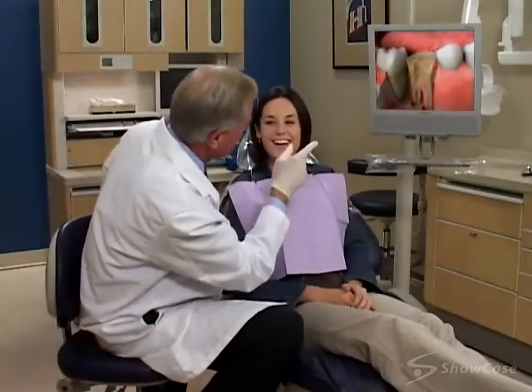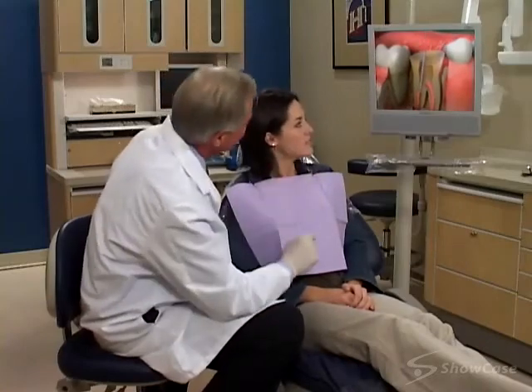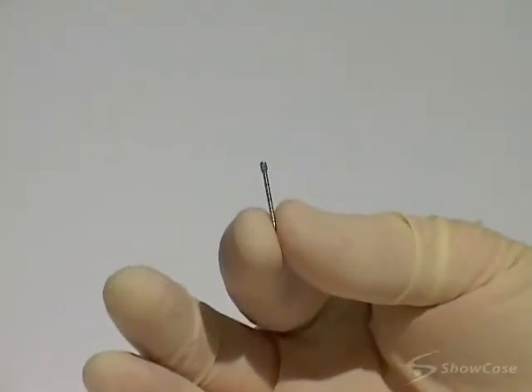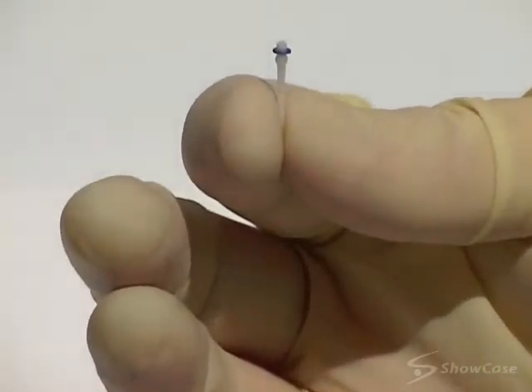We use a post and core to replace the missing portion of a severely broken down tooth after root canal therapy and prior to placing a crown. The post, often made of metal or fiber-reinforced resin, is used to anchor a core, which is also called a build-up.